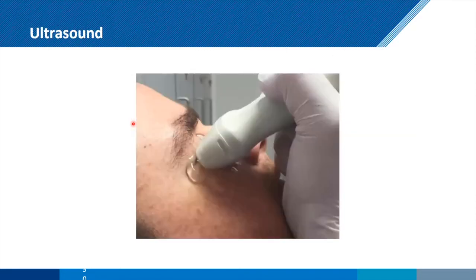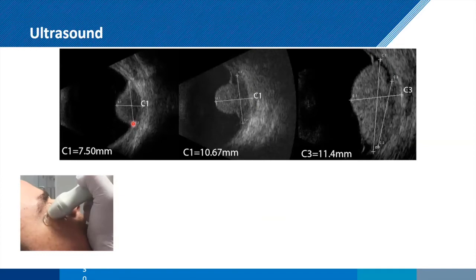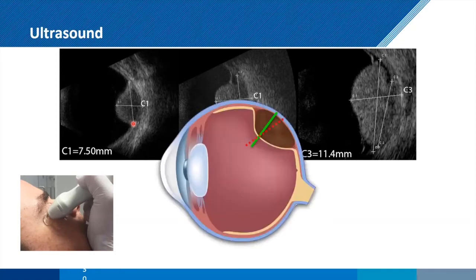And the standard way that this is done is with ultrasound. So you can see a high resolution, high frequency, probably 10 megahertz ultrasound transducer on the eye. And the kind of images you get out are like this. And you can see the problem here is that the ultrasound is very low contrast. It's quite difficult to see where the tumor hits the back of the eye. And also, of course, ultrasound is 2D, and it suffers from refraction. So any small changes in the angle of that ultrasound transducer are going to change the apparent size of that tumor.